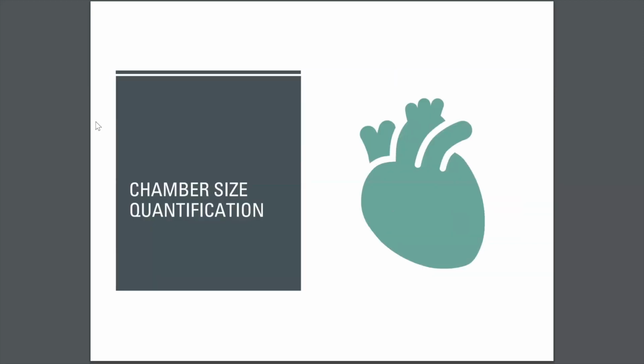So I'm going to briefly talk about chamber quantification guidelines, or a selected portion of the chamber quantification guidelines. This is a huge topic that I think warrants a specific 1 hour talk, so I'm not going to go into too much detail about it today.